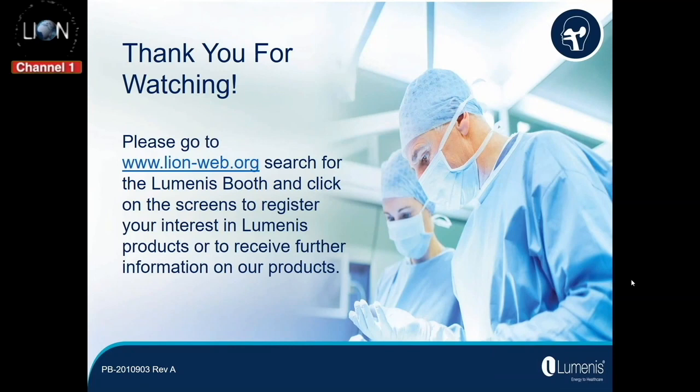I mentioned before that I would elaborate further on the line of sight problems. With the traditional CO2 laser microsurgery setup, the laser can really only be fired in a straight line, and usually that's around 400 millimeters. So if the targeted tissue is not in the line of sight of the operating microscope, it's going to be impossible to treat that with the CO2 laser. For example, in the lower airway tract or the pharynx.